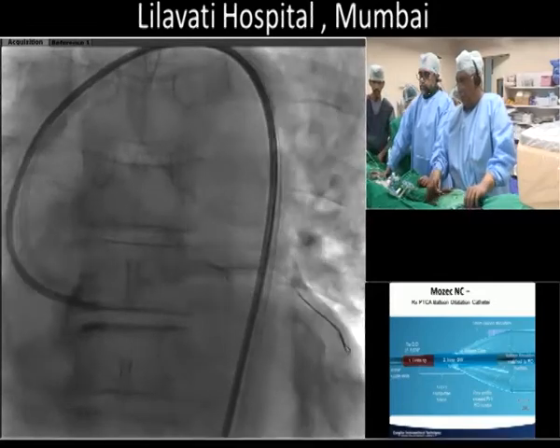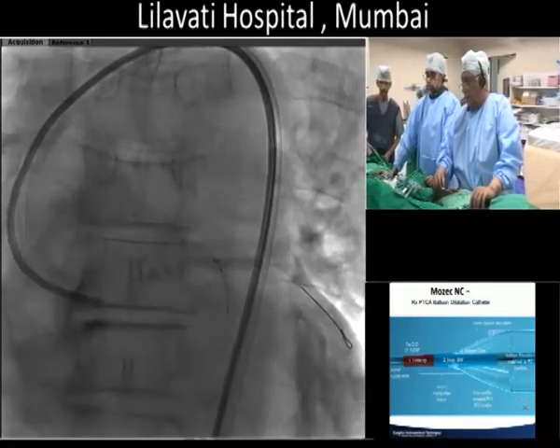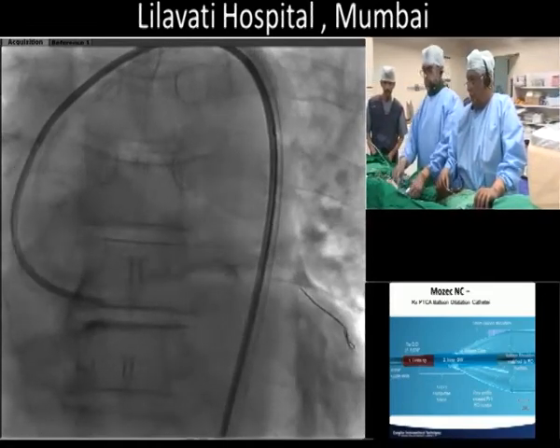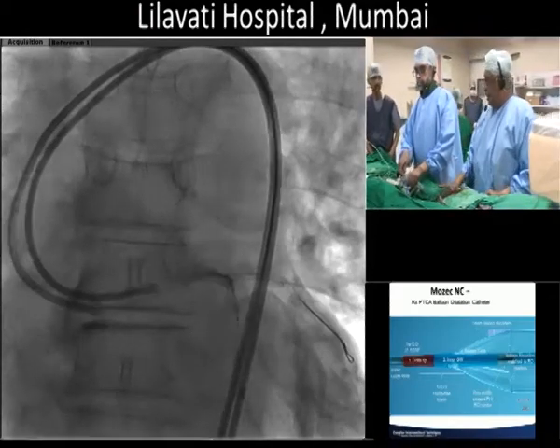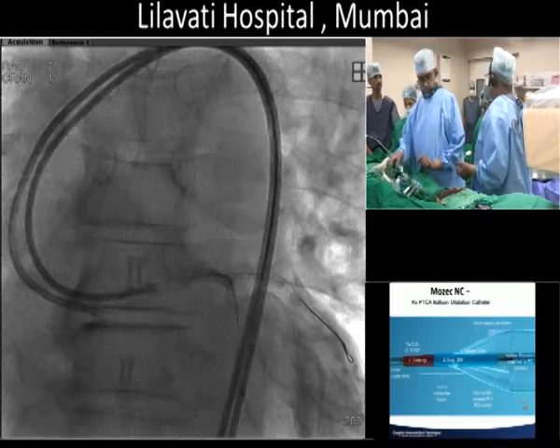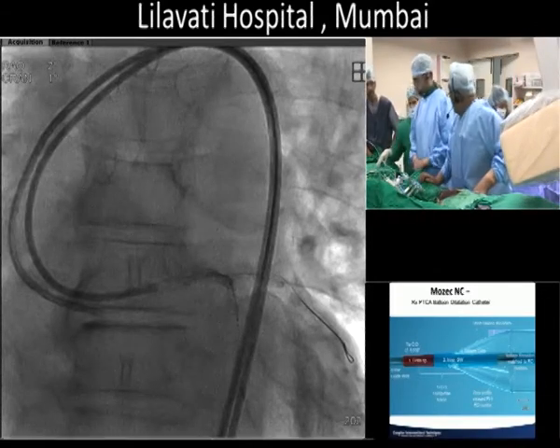So I'm going to work from the left for the circumflex, and give me a BMW blue wire.